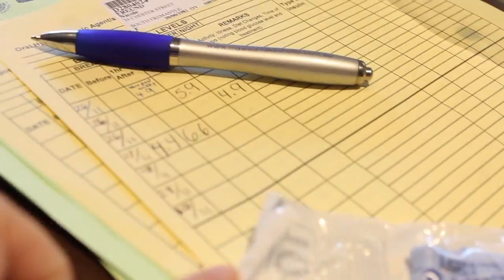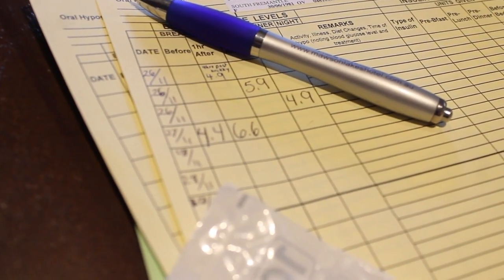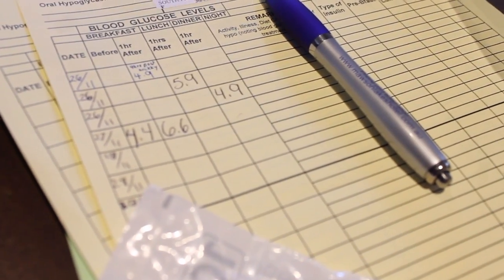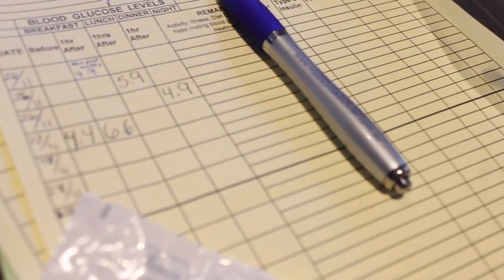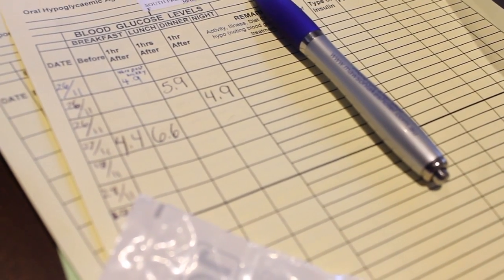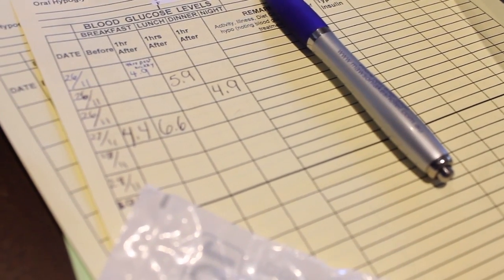I have my, it's not a book, a log paper. So you see you have the date on the left, you have before breakfast, which is your fasting in the morning, 1 hour after breakfast. There are women who do test 2 hours after meals. I am a 1 hour tester. Then 1 hour after lunch and 1 hour after dinner. And then there's a comment section in case there were any anomalies, if you want to describe if you were feeling ill or there was any sudden change that could have caused such an unusual reading.